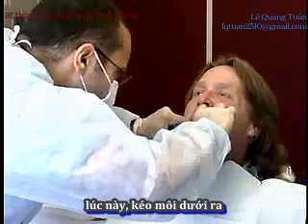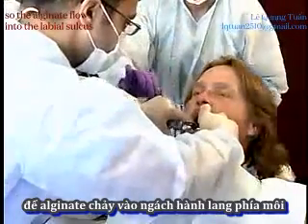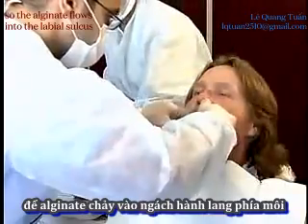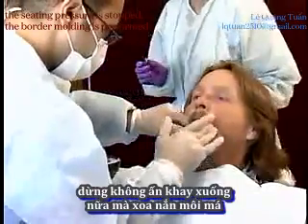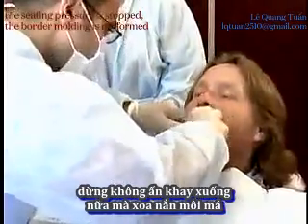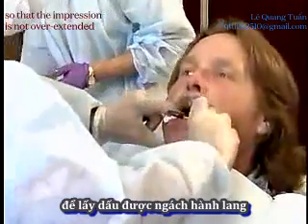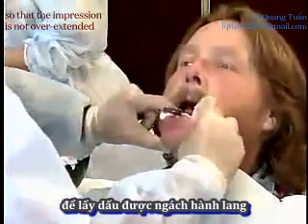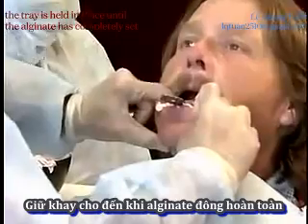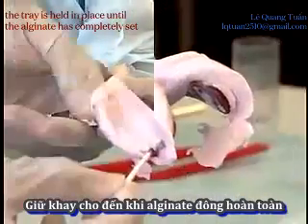The lip is pulled out so the alginate flows into the labial sulcus, then the seating pressure is stopped. Border molding is performed so that the impression is not overextended. The tray is held in place until the alginate has completely set.